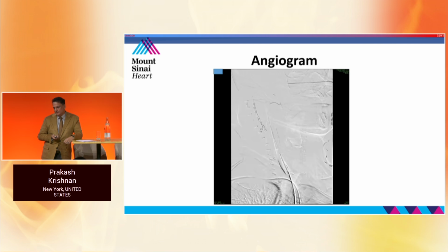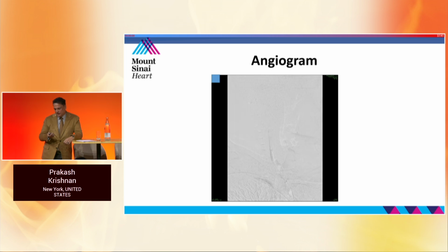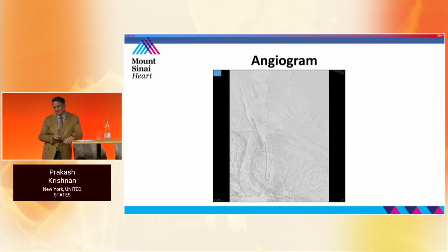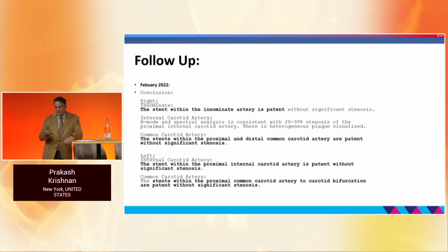And then with that, long case here, let me keep going forward. We were able to establish flow with the innominate stent, the dissected segment with a true and false lumen in the ostium of the common carotid, and then a distal stent tacking up the distal dissection plane with flow in the right internal carotid and flow in the left internal carotid with 3 stents. So again, Eric wanted a complication. We got a complication. So at this stage, after everything was done, the patient recovered.